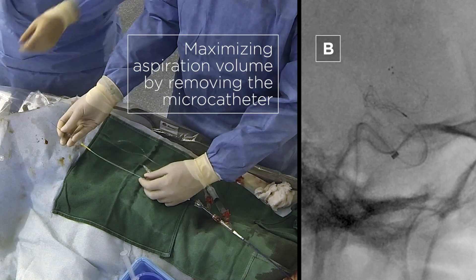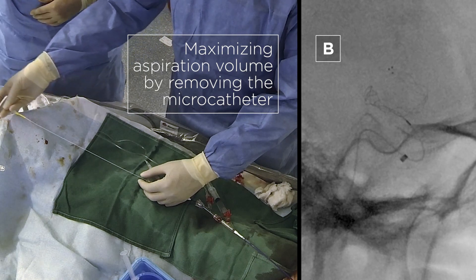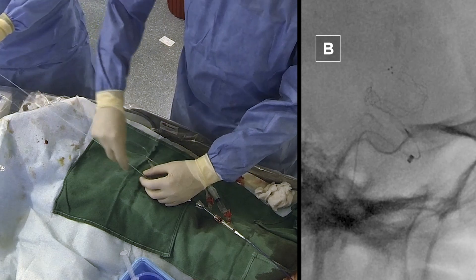We always try to remove the micro catheter, as described in the bare wire technique, to create more volume in the aspiration catheter for aspiration. The idea is to maximize your aspiration volume — that's why you remove the micro catheter. A question that sometimes comes up is whether removing the micro catheter causes dislocation of the stent retriever. Personally, this has never been a problem, so it's not really an issue. Removing the micro catheter with the stent retriever in place maximizes the suction force of the aspiration catheter, especially with big clots and long stent retrievers.